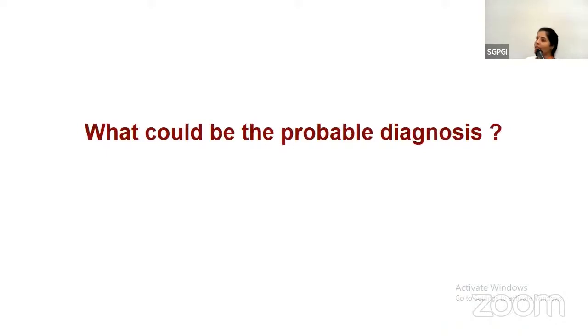So now again, the same question. What could be the probable diagnosis, or what is the next thing that pops into mind?